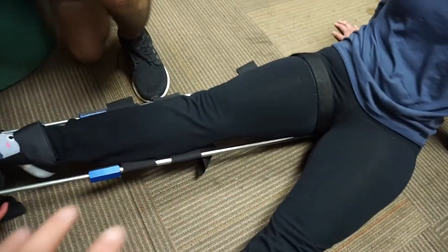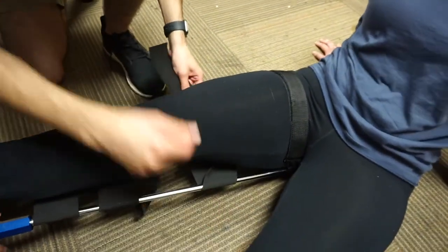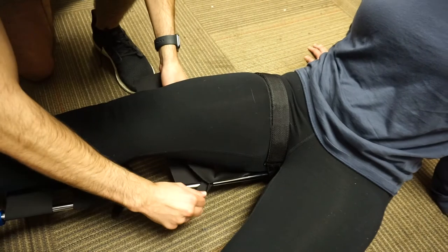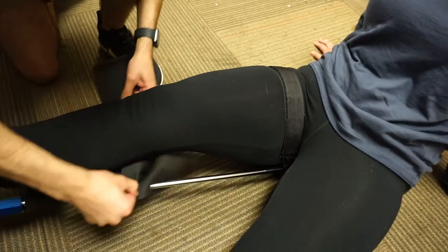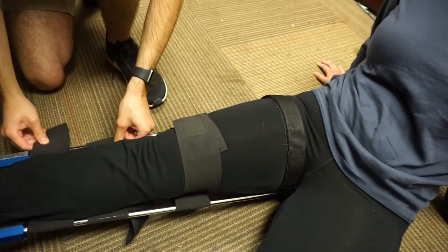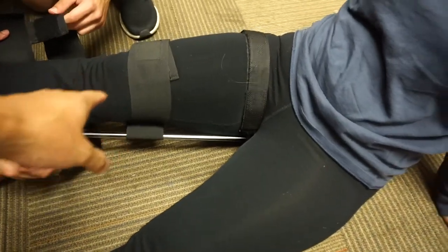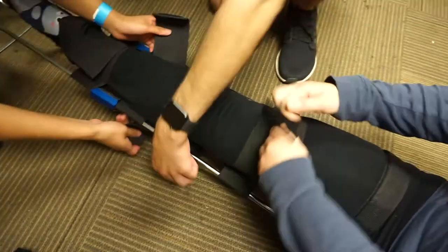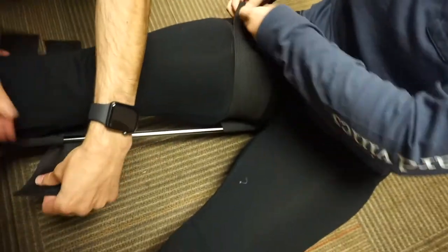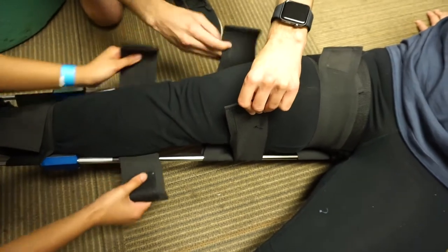Now we can apply the four elastic bands. There are going to be two elastic bands above the knee and two below the knee. None of these bands should go directly on top of the injury. One is also going to go right on top of the ischial strap area, above the ischial strap. Good — I like the teamwork.